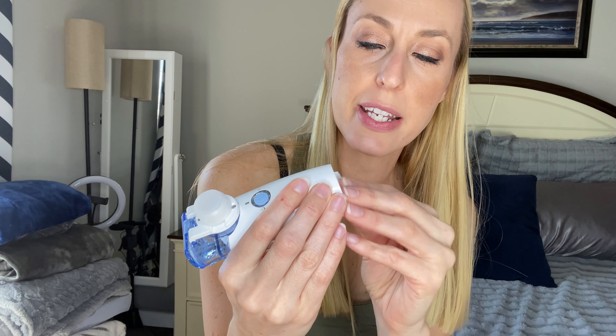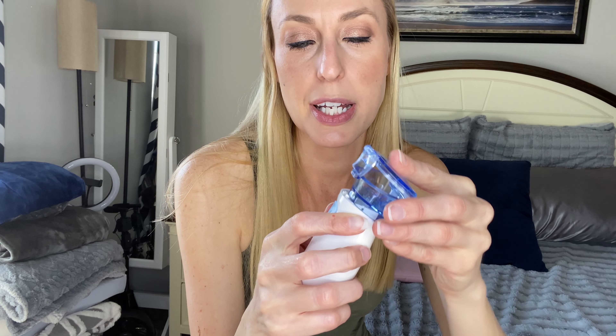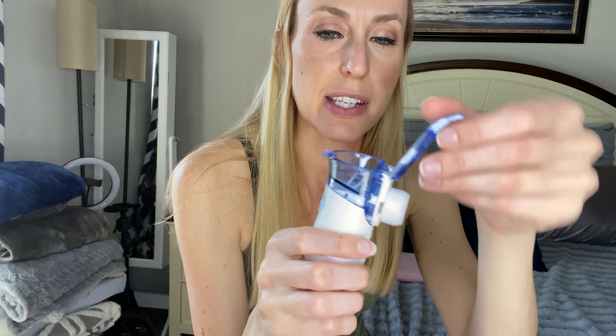There are three different things. So in the very bottom, you will slide this bottom part off, and it takes two AA batteries, so you would slide right in there, and then close that up. You want to make sure that this top part is connected, so you'll hear a click, and that will tell you it's connected.